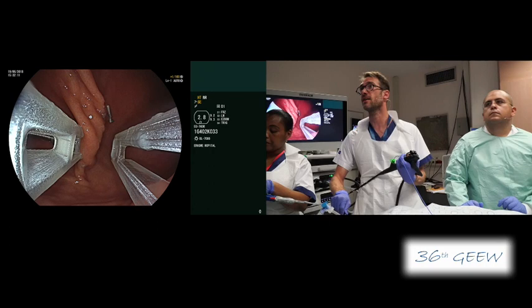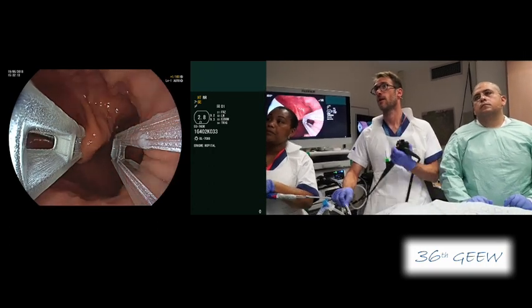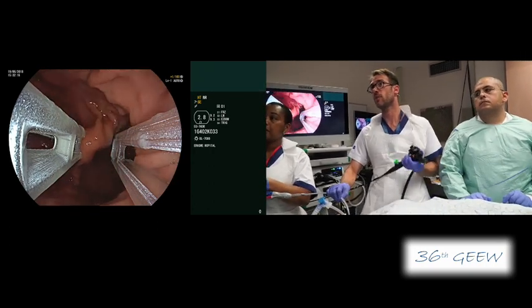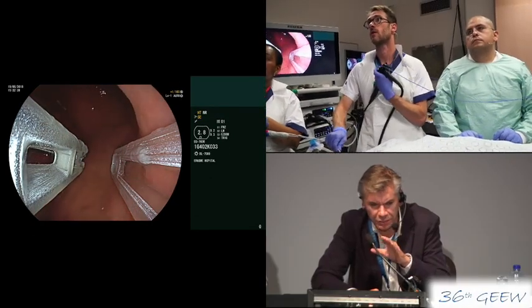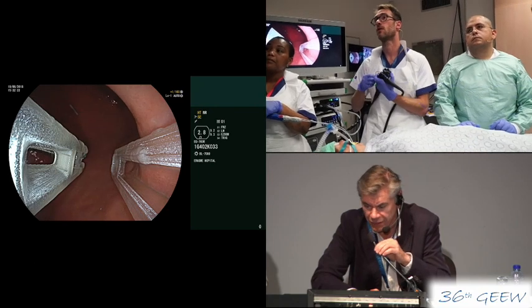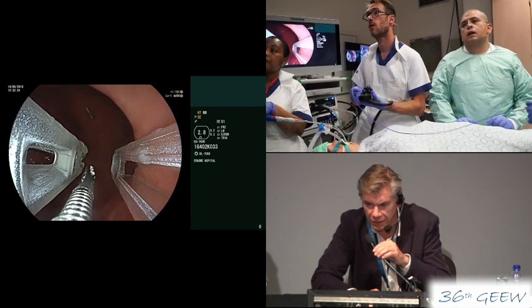You see now we have the first tag there. I'm pulling back a little bit — just advance a little bit the needle. Vincent, you can move on at your own rhythm. We will move now to the next case because they are ready and we'll come back to you afterwards.